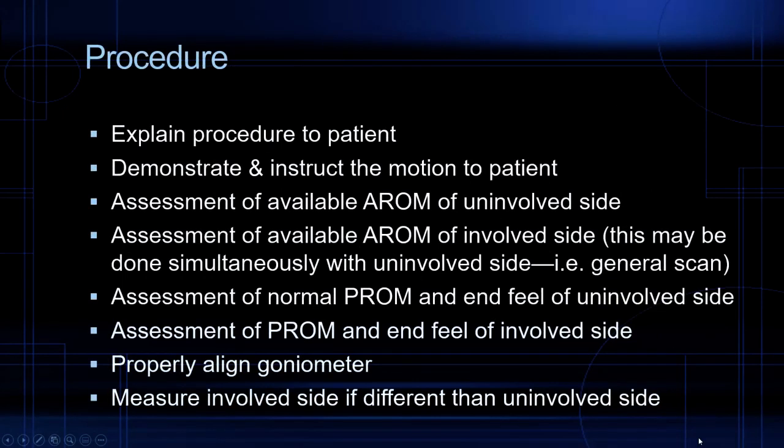So here's the procedure you're going to follow every single time you measure a joint. Okay, now this is listed in your handout. I also have a little example video of my coworker Tess being a patient for you guys a couple years ago, showing what I will expect to see for a skills check. Okay, you're going to do a brief explanation of the procedure. You always demonstrate the motion. So this can be quick. Say, hey, Jane, I'm going to look at your shoulder range of motion today. That looks like this. And then I show her, I lift my own arm up into flexion.